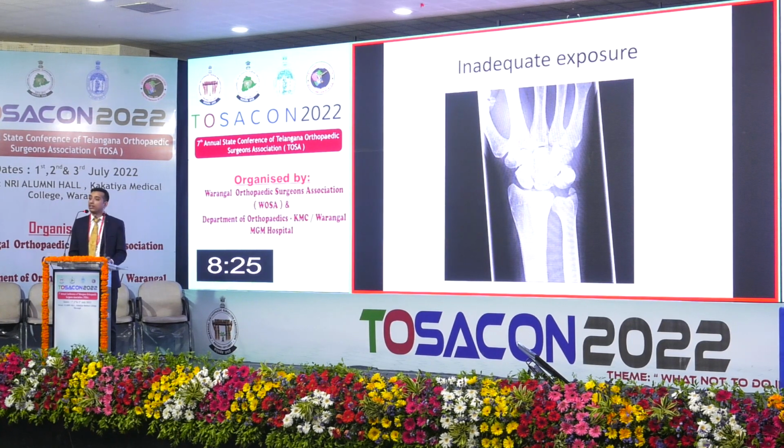Similarly, inadequate exposure. When the patient presented to him, because of budget constraints or something, the consultant took only an AP view, and he thought it was just an ulnar styloid fracture. He immobilized and sent him away because he thought the ulnar styloid fracture would heal.